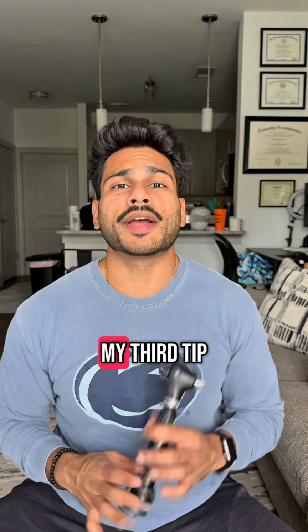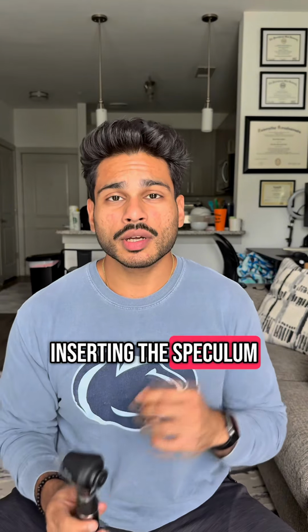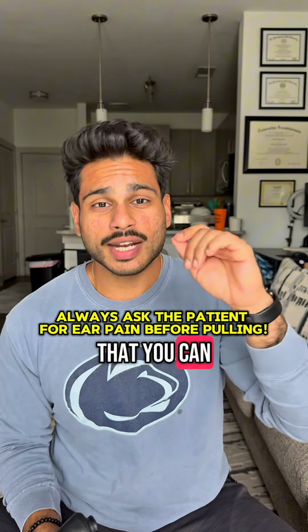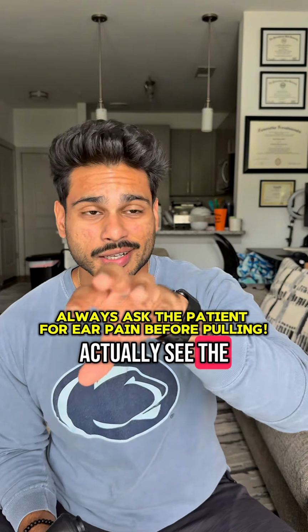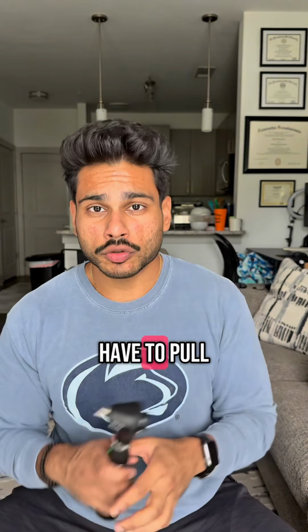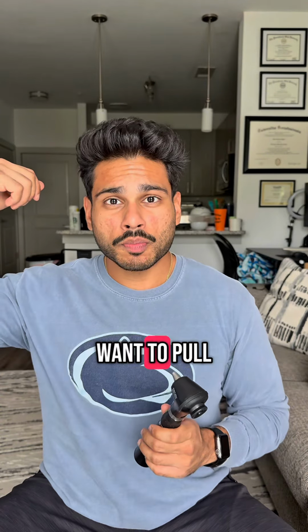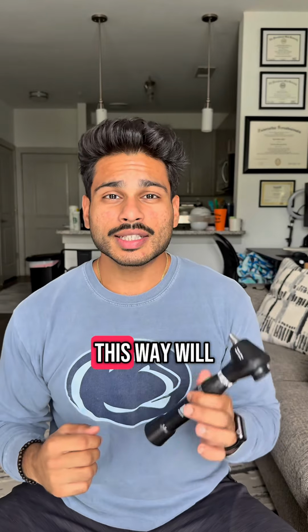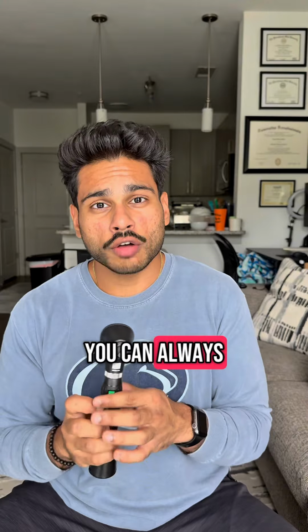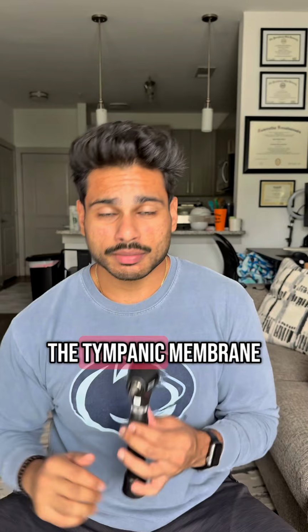My third tip is before actually inserting the speculum, you have to manipulate the ears in a way that you can actually see the canal and the tympanic membrane. For peds, you have to pull out and down. For adults, you want to pull up and out. This way will allow you to see all the structures clearly. And if not, you can always maneuver the speculum to see where actually the tympanic membrane is.